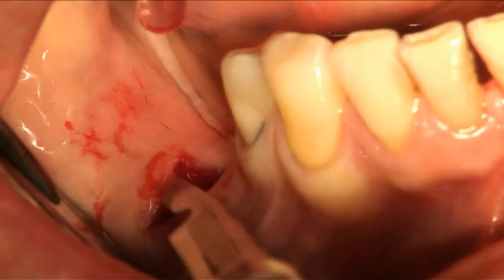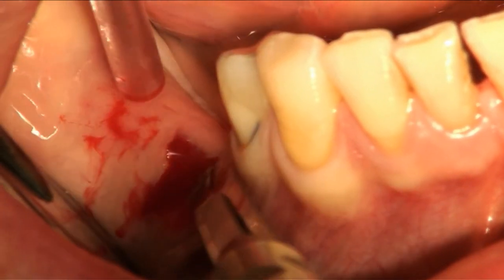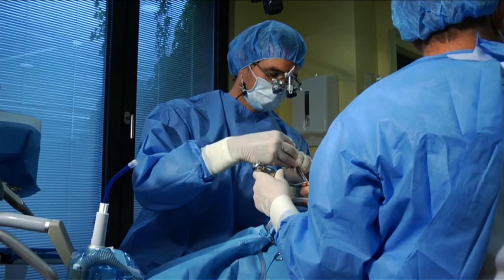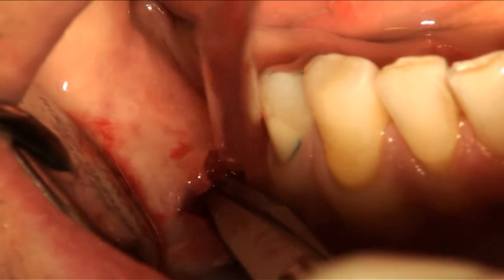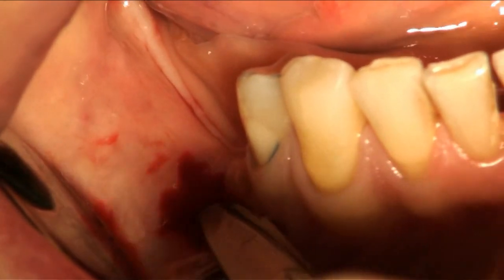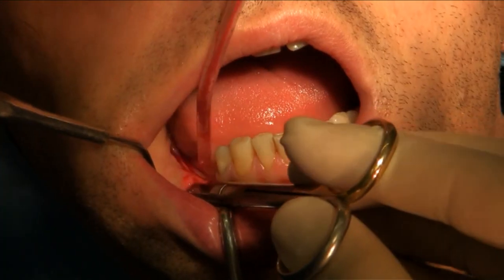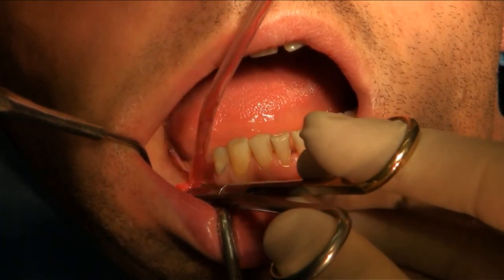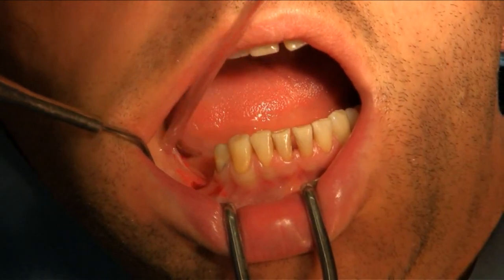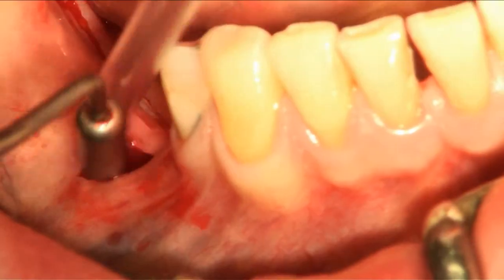And still we do not cut the periosteum. Then we start with a blunt dissection of the pouch using the scissors. Finally, we check the preparation using the surgical template.